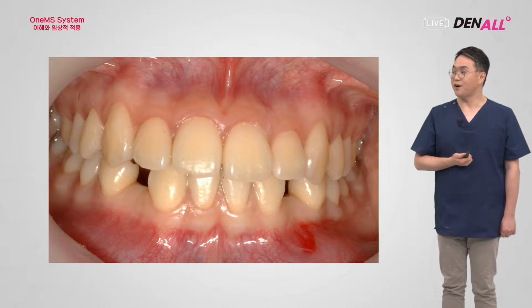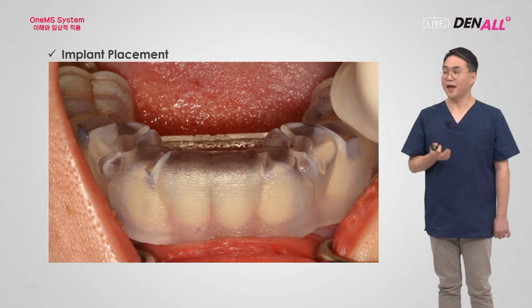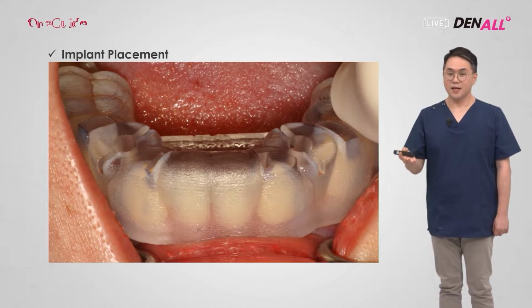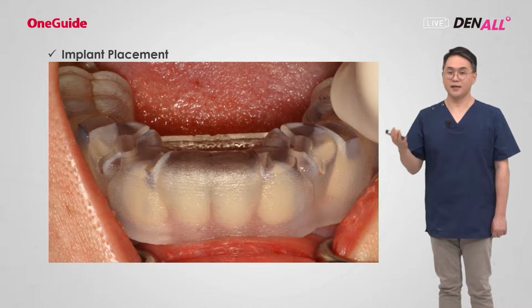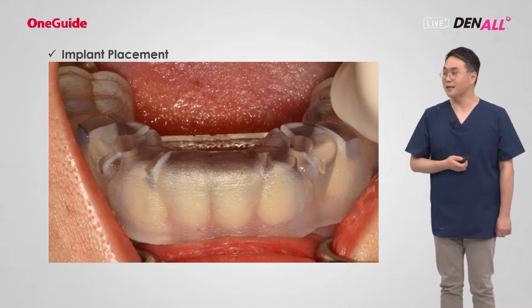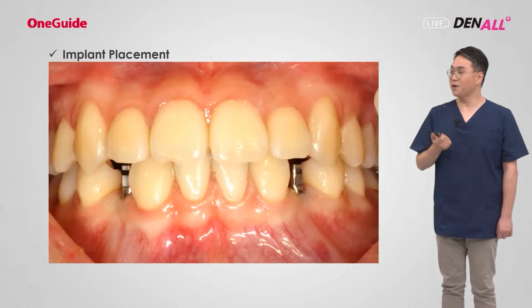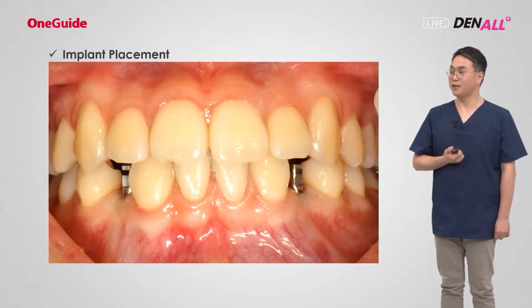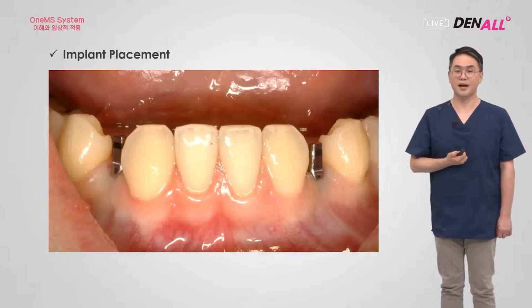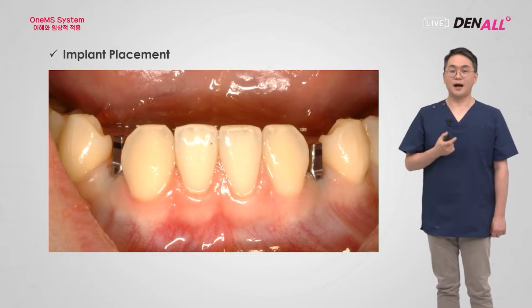So this is the front photo, and hence I decided to place an MS implant using the OneMS system kit. I took photos, took the scan, and sent it to the digital center, and received this template from the center, placed it in the mouth, and placed the implant. Two implants, flapless. It went according to plan. I had good initial stability. This is the after photo.